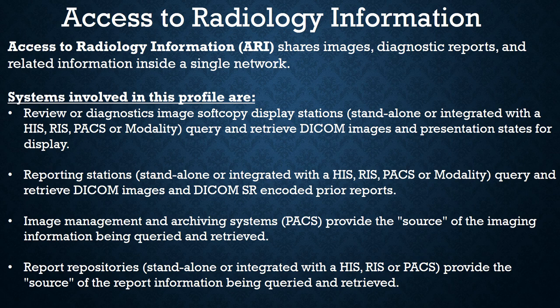So review or diagnostic image soft copy display station, standalone or integrated with HIS, RIS, PACS, or modality. Query and retrieve DICOM images and presentation states for display. Reporting stations, image management and archive systems, which is basically the PACS, and report repositories such as the HIS or the RIS. All of these will work together, and this is how you give access to radiology information.